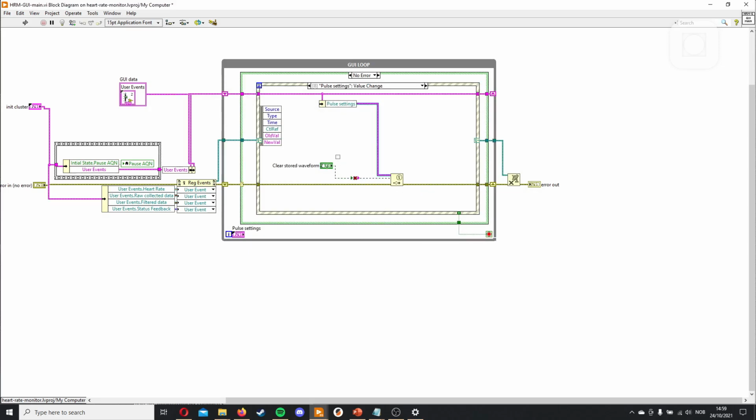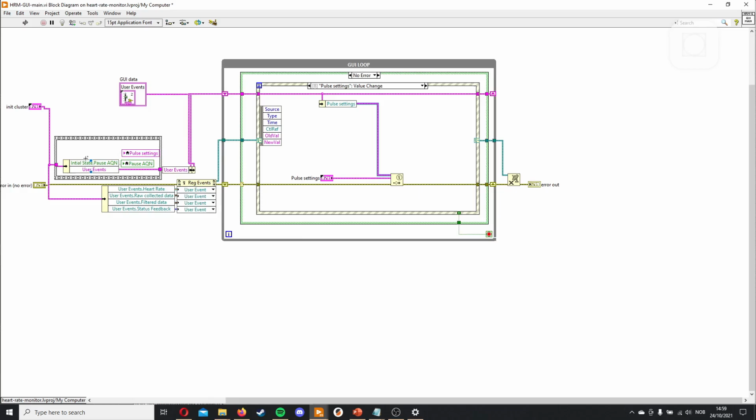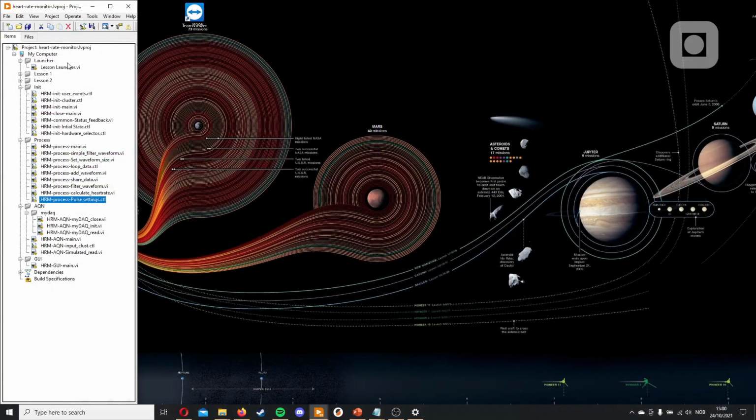And we'll need to change this one, delete here, and then place it in here. Now we have the sending in order. Anytime there's a change, we will do the sending. We'll also add the initial values here. This way we know we have the same initial values both on the acquisition and in the GUI. And that's everything we need to do in the GUI.